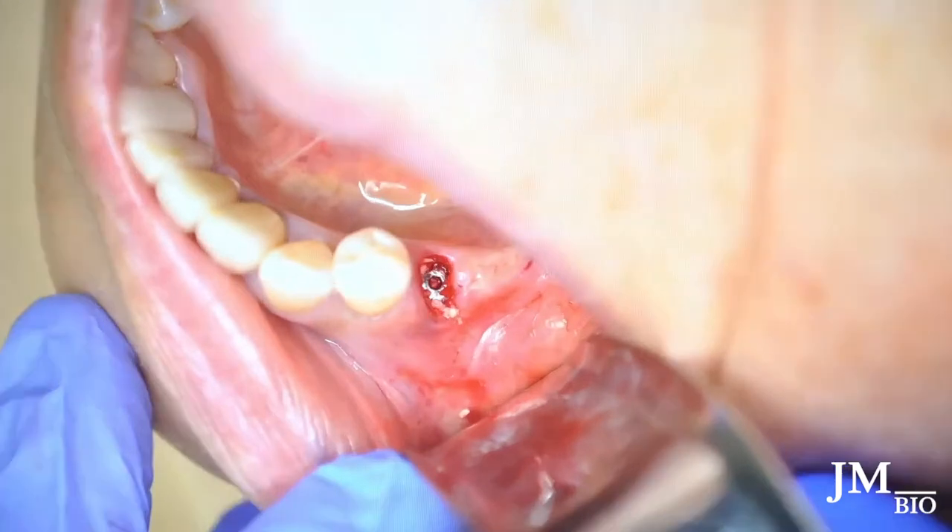I like to create a seal with the healing abutment if I can — it's important to have good stability. Once you cover it up with the healing abutment, it creates a better seal, less space for tissue to grow into, and makes for better healing overall.